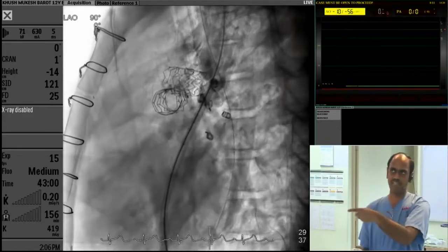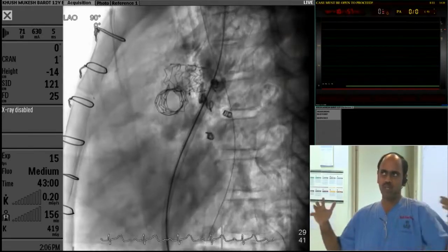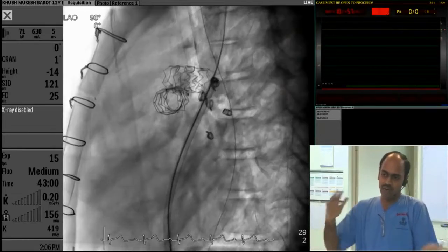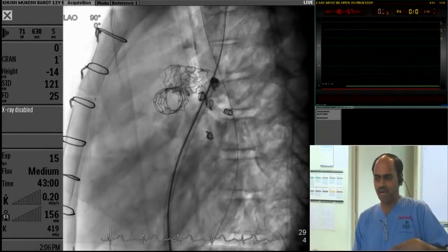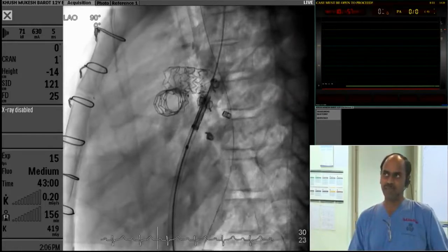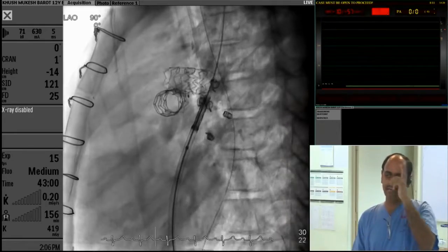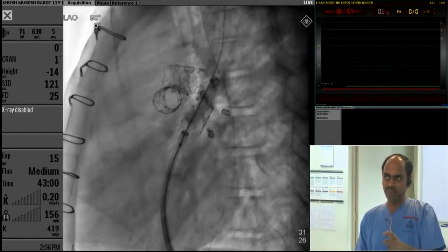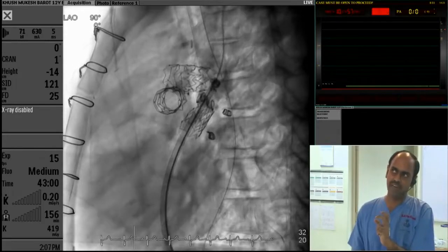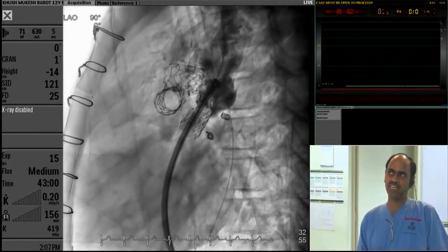The reason why the azygous started to fill from a pulmonary vein injection was that whenever there is chronic superior vena cava obstruction, the bronchial veins tend to drain towards the azygous. When the superior vena cava is occluded, there are a lot of venous collaterals between the pulmonary veins and the azygous system, so the pulmonary venous injection generously fills the azygous. I was actually stenting the right upper pulmonary vein — this is a clear pulmonary vein wedge injection. I was filling the entire pulmonary veins but my eyes were not recognizing it. I pushed the sheath deep into the pulmonary vein and made a harsh wedge injection through a full sheath, wedging against it and making a big injection — so I was dissecting into the lungs.